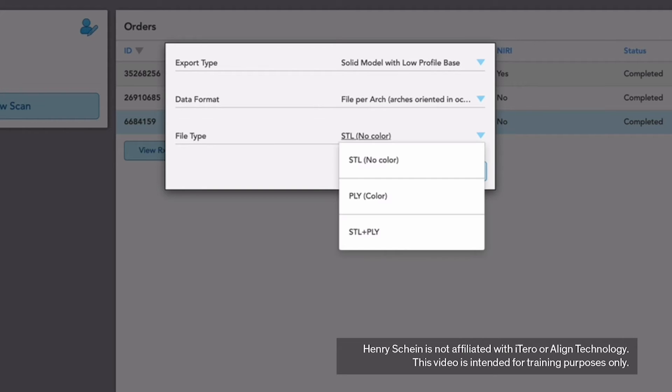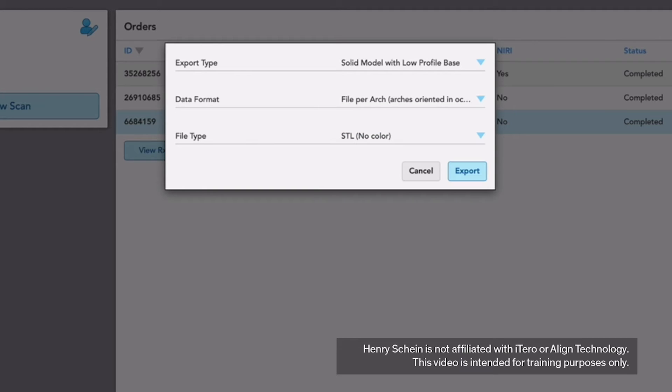File Type: Choose STL, no color. If you see a drop-down menu for file size, leave unchecked, as the default option is High Resolution.